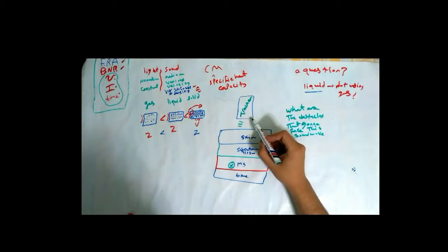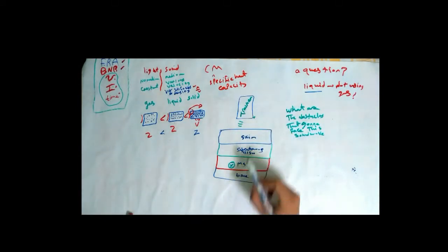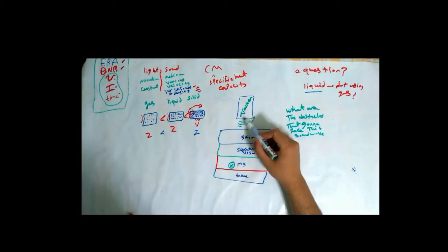First is the acoustic impedance interference between the transducer head and the air, and treating it by using a liquid or a material that has acoustic impedance close to the skin and the transducer head. So we use here a jelly to avoid loss of sound wave energy at this area.